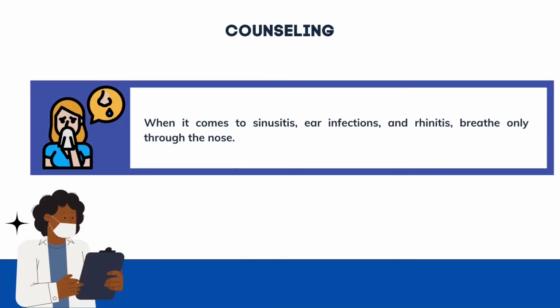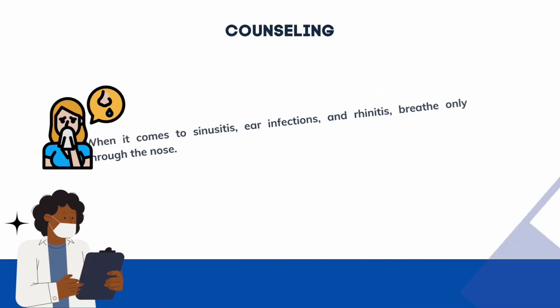Meanwhile, when it comes to sinusitis, ear infections, and rhinitis, breathe only through the nose. Also, when using a nebulizer for these conditions, try to concentrate all the breathing techniques on the organ that is inflamed, which is the nose.